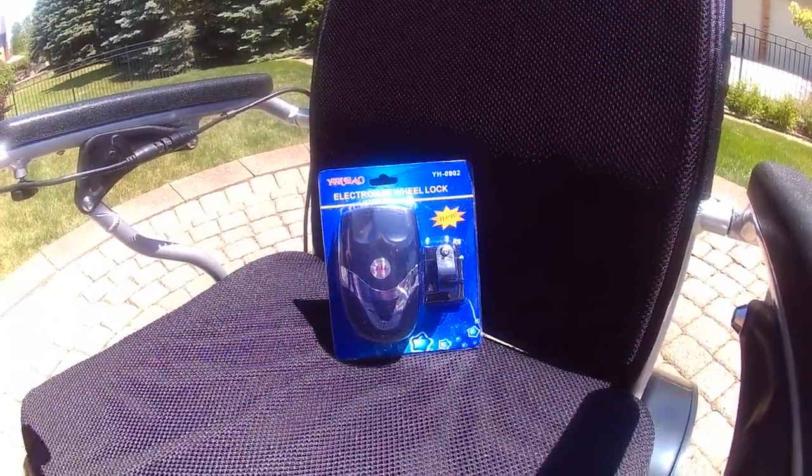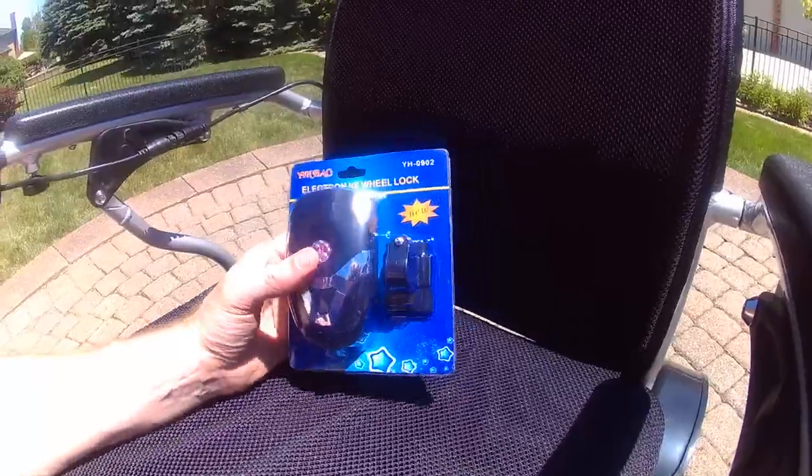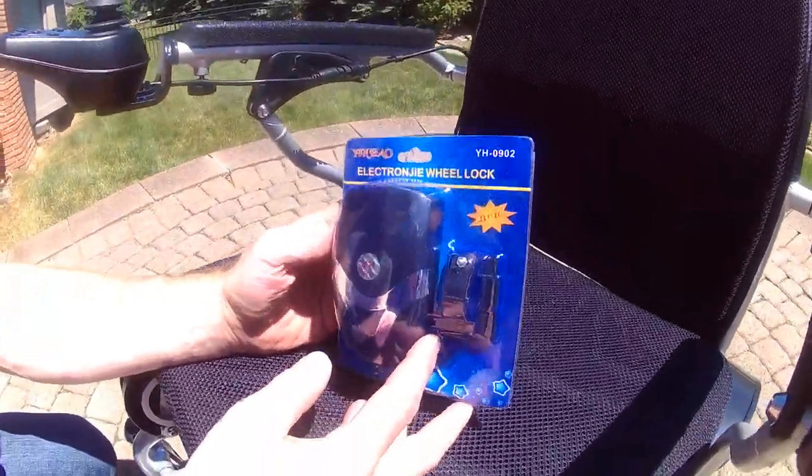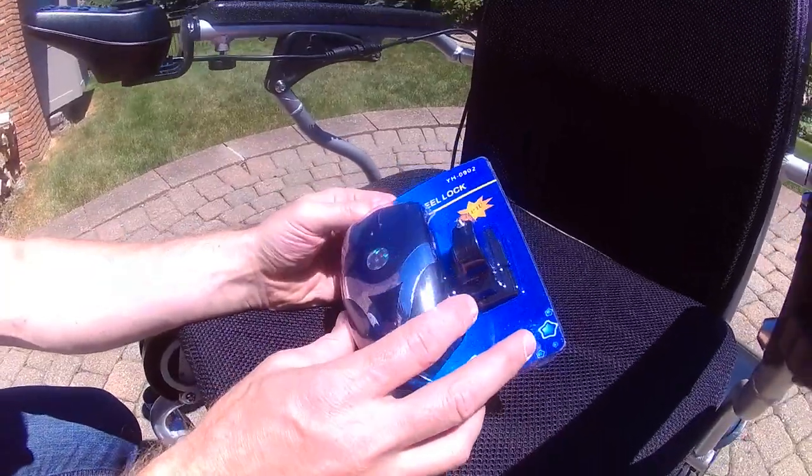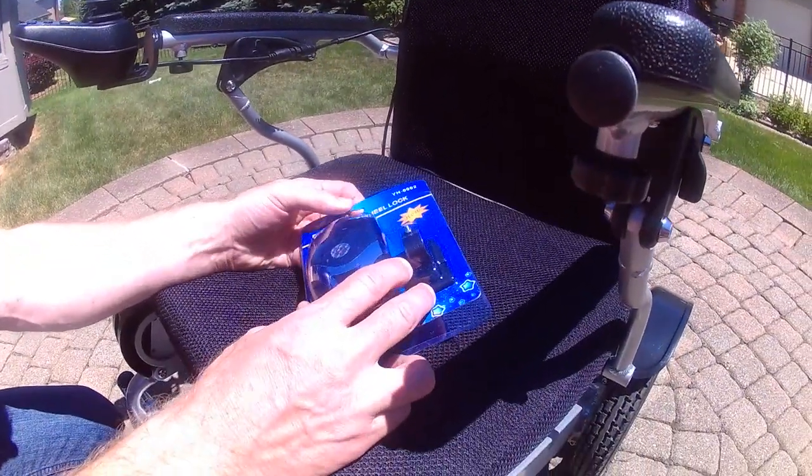We will go over in this video how to attach the dual pitch horn slash light to your Eagle or AHXLS foldable power wheelchair.